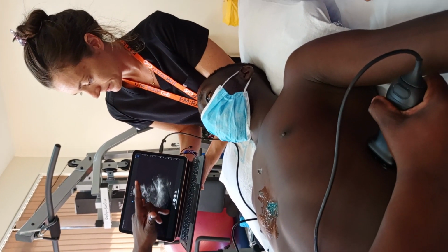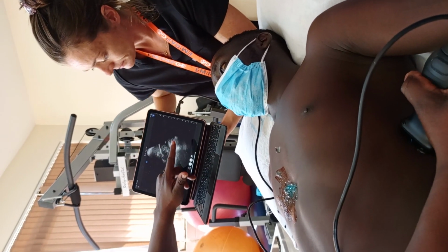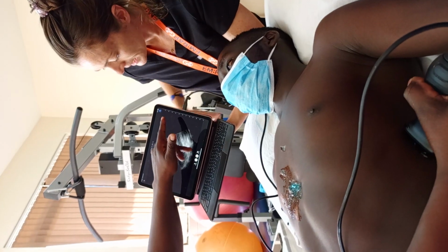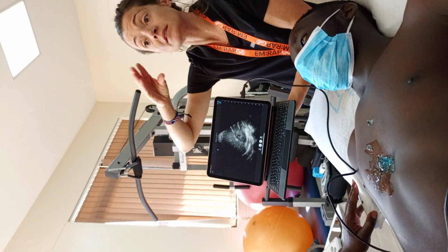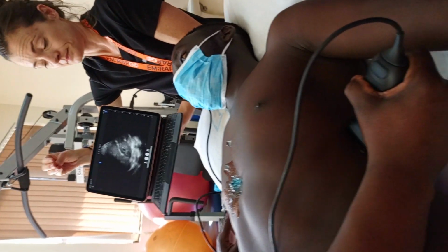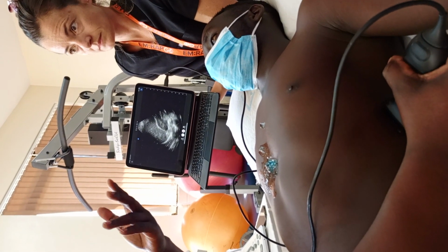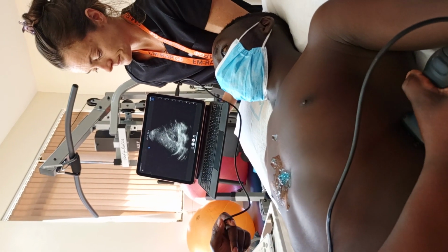Beautiful. This is the spleen. And this is the left kidney. So you are looking for the space between the spleen and the left kidney. That bright white is the two organs touching. We should see bright white. When we start to see black in between there, that's blood. Also, like the other case, if you see free fluid here, can be effusion, can be hematoma, any free fluid here, you should also report for that.